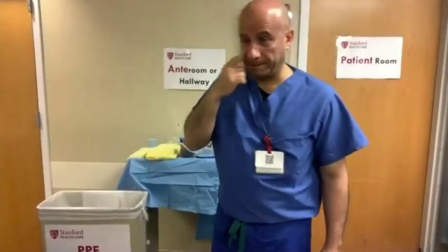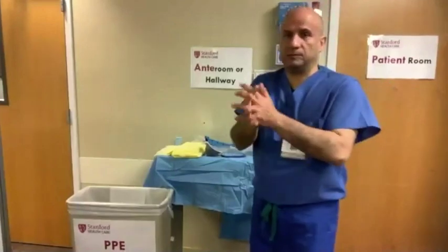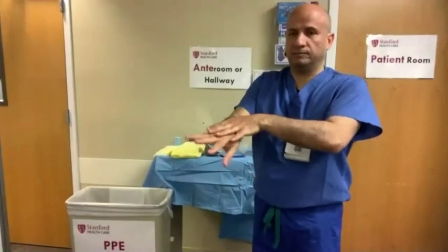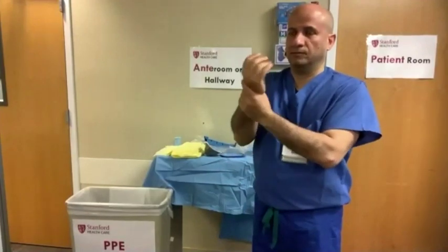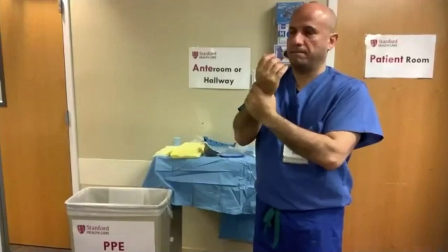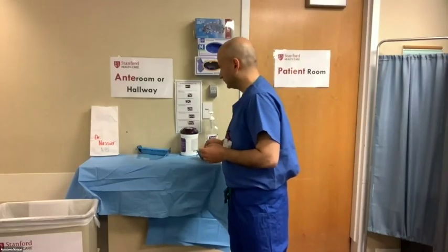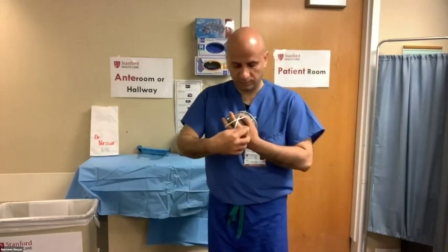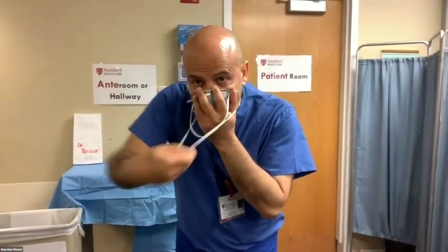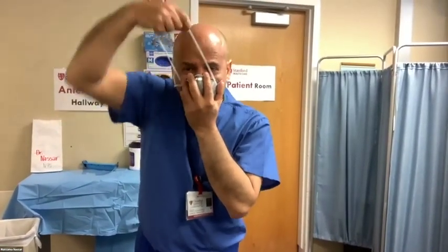The final step is to sanitize your hands again for 20 to 30 seconds. Then we'll do the last scenario, which involves cleaning of the face shield as well as mask reuse. Imagine Dr. Nassar is still in the patient room, gowned and gloved as previously described, with his N95 mask on as well as his face shield.